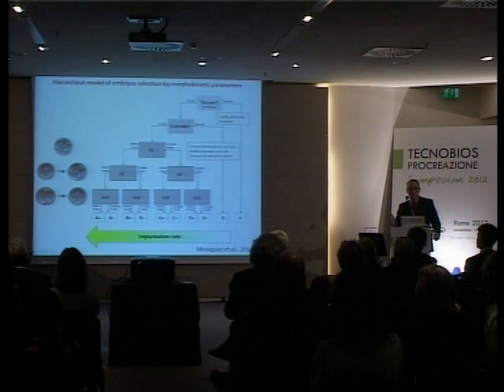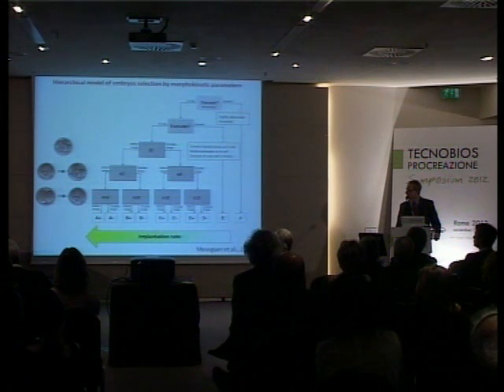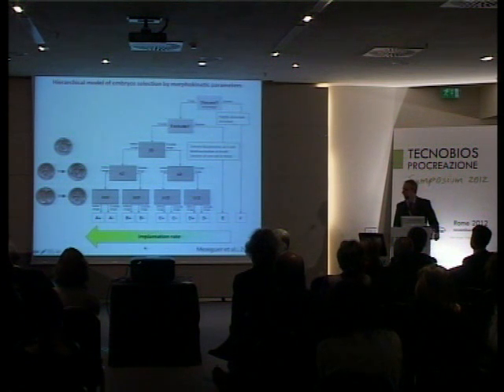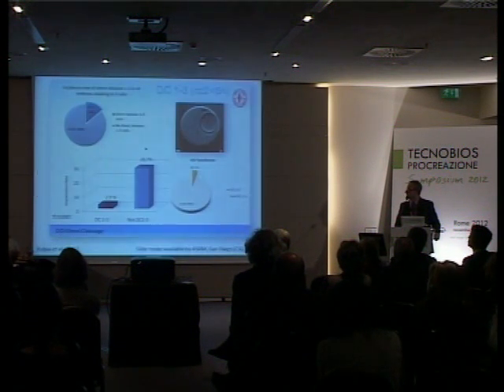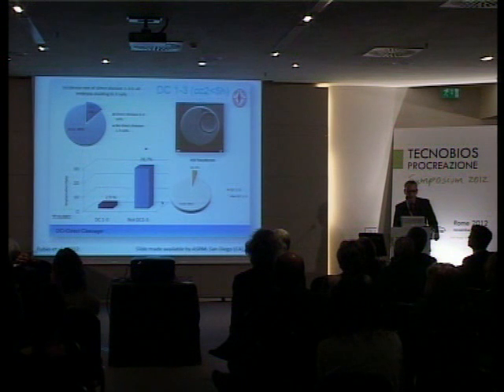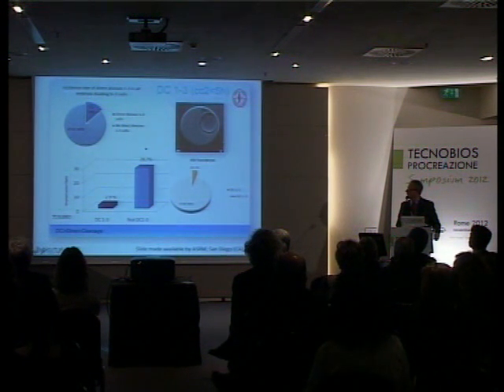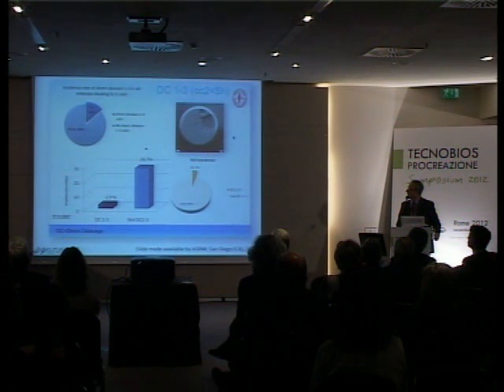So there is an association with a certain linearity between morphokinetic parameters and implantation ability. And I would like just to show a specific case in which we can see how in some cases morphokinetics can be so powerful. This refers to the case in which a fertilized egg divides directly into 3 blastomeres, as it is shown in this video.